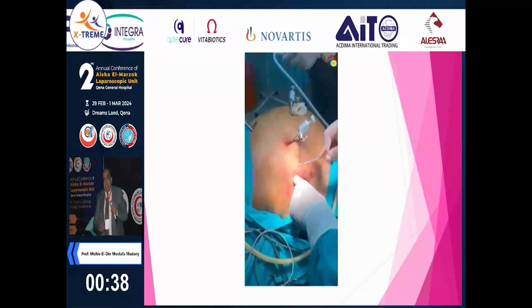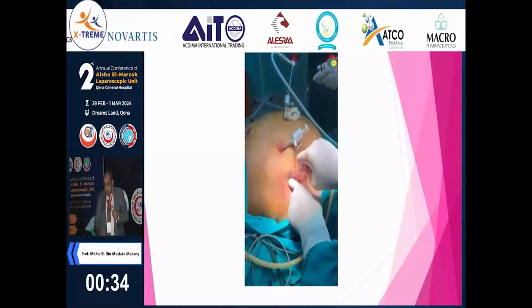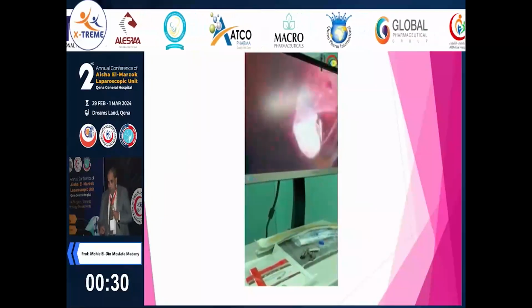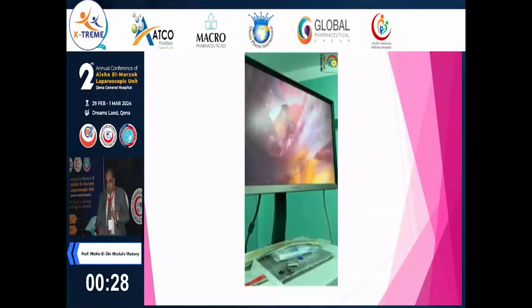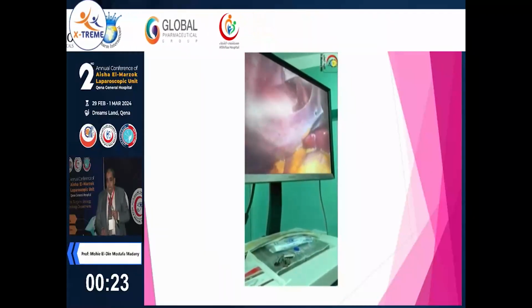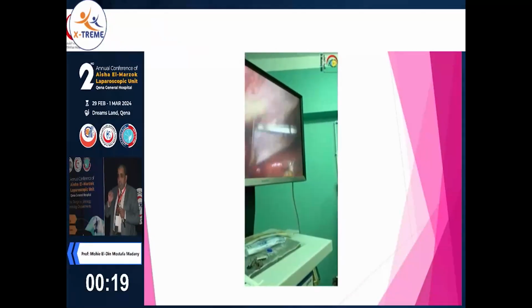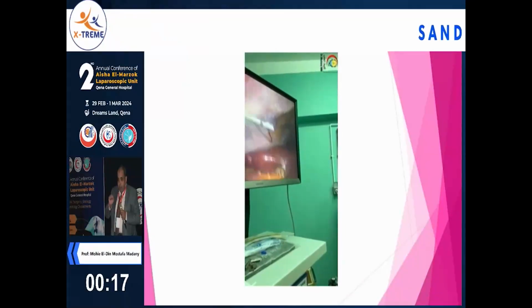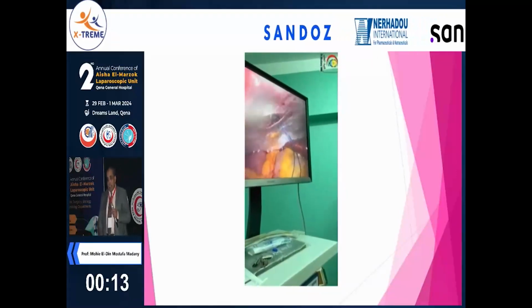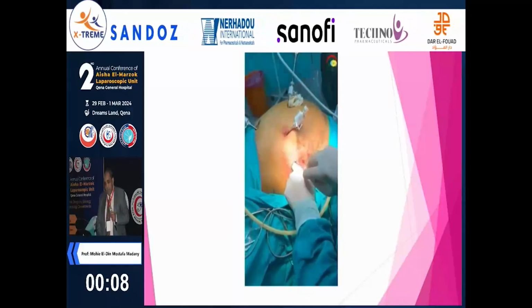As it is a novel device, I repeat the video, if there is time. This is the complete video for the steps of Nasr Fascial closure device. The trick in this maneuver: you must push the needle more in the peritoneum to dislodge the thread from the device.